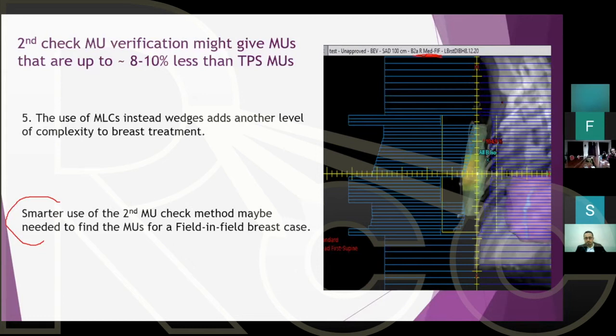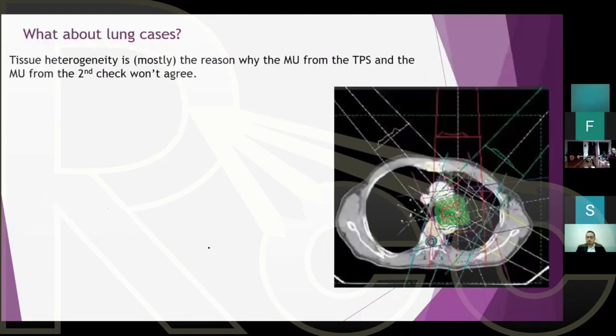I consider it a separate field. And I enter, okay, I have this X, I have this Y. And for the percentage of block, I include the percentage blocked using MLCs or regular blocks, plus the air. Sorry, the beam's eye view is not clear, but you still have air here. So you can consider the field-in-field as separate fields by themselves, and you do the calculation. It's going to take more time from you. Okay, now the lung case.